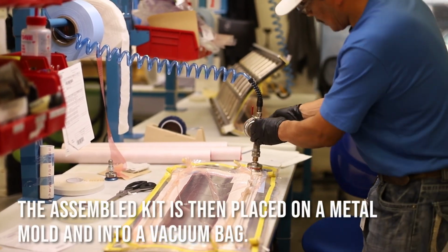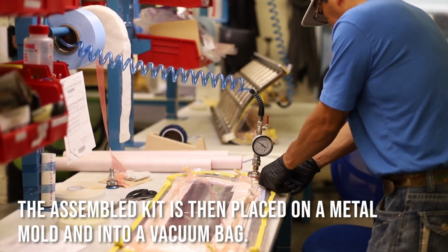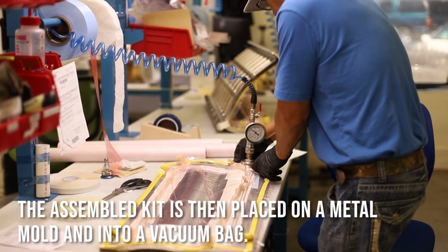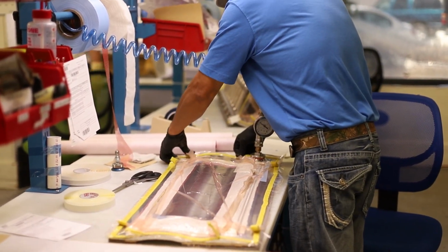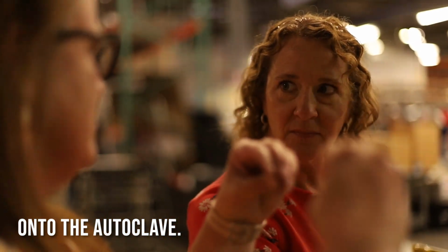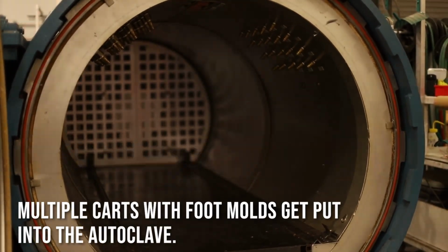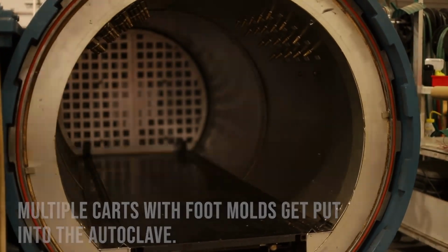Yeah, so you vacuum all the air out, so that bag acts as your force. And when you put it in the autoclave under pressure, it just pushes evenly everywhere. You'll close the door, put it in there, and it will hold the vacuum throughout the cure, but it also applies pressure on the outside. So 90 psi of pressure. So every square inch of this part has 90 pounds pushing on it over the whole thing. So it's a lot of pressure over the whole part.